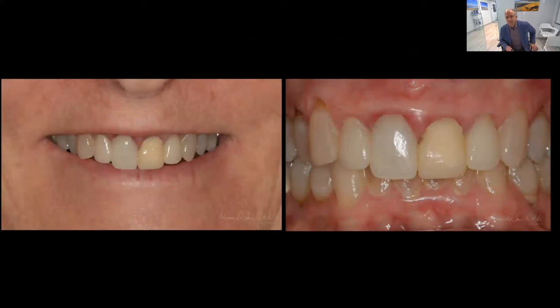So if we look at a few cases, tooth number 8 in this situation needed to be extracted, and her lip line is right at the zenith of the tissue of that gingival margin of tooth number 8. But when I look and I retract, she has a lot of keratinized tissue, a lot of thick tissue. So this is a case where if I'm going to place an immediate implant, I might be comfortable placing that if my planning looks appropriate.